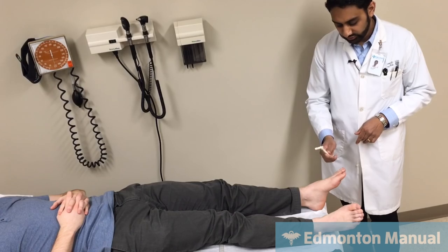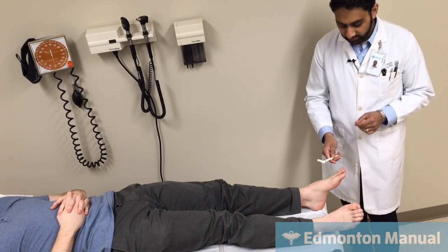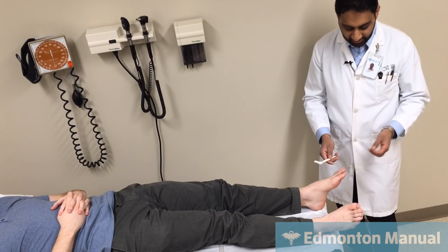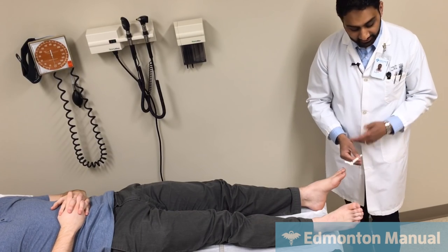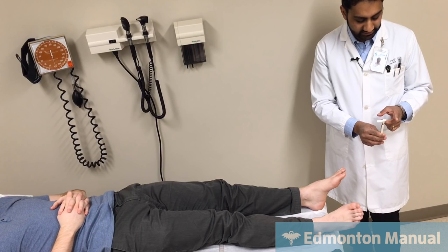So that's how you use the monofilament. One of the things that I want to emphasize is the actual guidelines may change in terms of where you test, how many times you test, but the key principles are always test on the sternum to make sure they know what they're feeling, then test the area, and do make sure that the monofilament does bend that little bit.